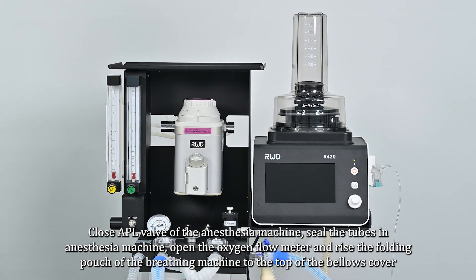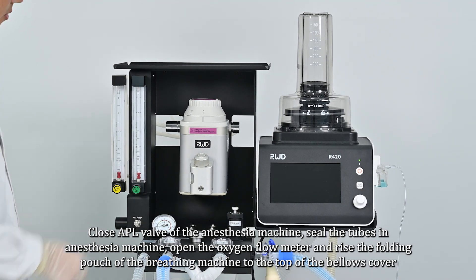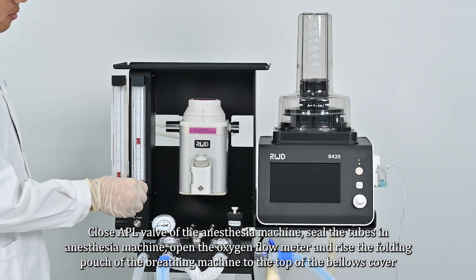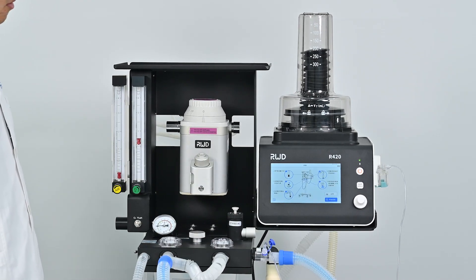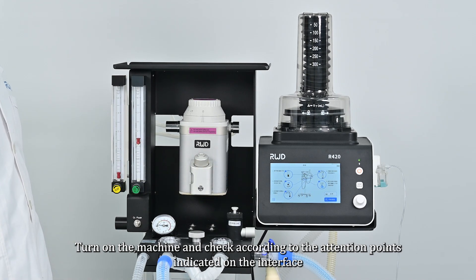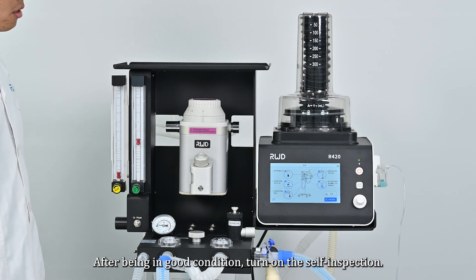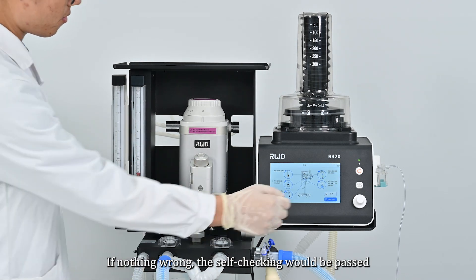Close the APL valve of the anesthesia machine, seal the tubes in the anesthesia machine, open the oxygen flow meter, and raise the folding pouch of the breathing machine to the top of the bellows cover. Turn on the machine and check according to the attention points indicated on the interface. Then start the self-inspection; if nothing is wrong, the self-check will pass.